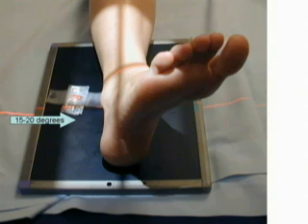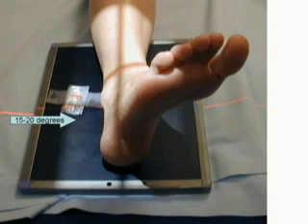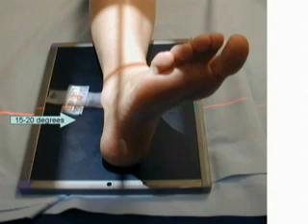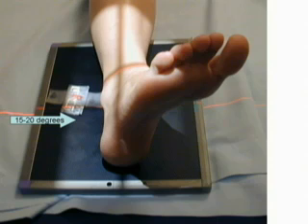Direct the central ray perpendicular through the ankle joint. Collimation improves radiographic contrast. When making the exposure, the patient should remain very still, but suspended respiration is unnecessary.